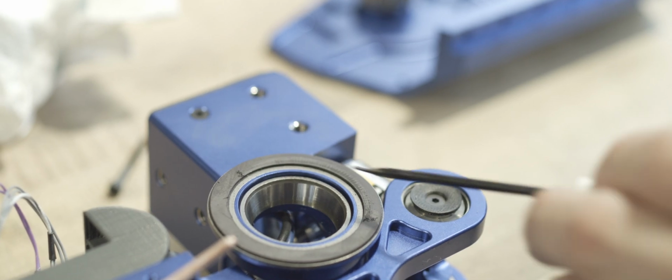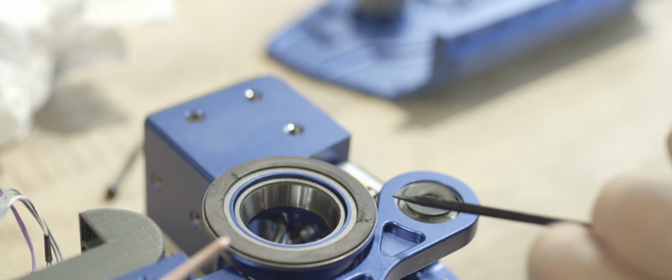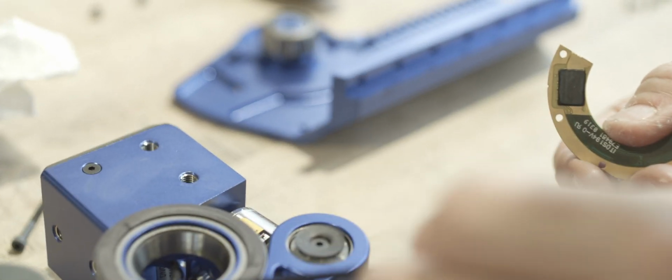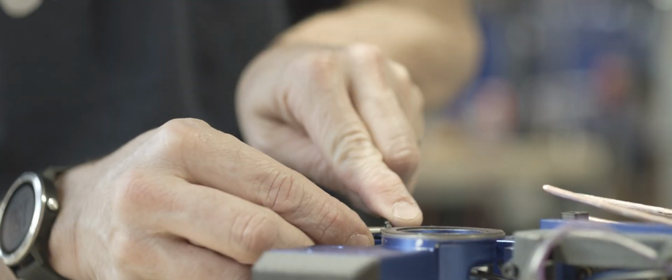So the ring encodes the position of the output. So in this ring are magnets that are very specifically arranged. So when this read head sees those magnets, it knows exactly the rotation of this ring. So now that this is damaged, it's not going to work. So I have to pop this ring out. Since we only use 120 degrees of the rotation, I can rotate it about 180 and now I get a good portion of the ring.